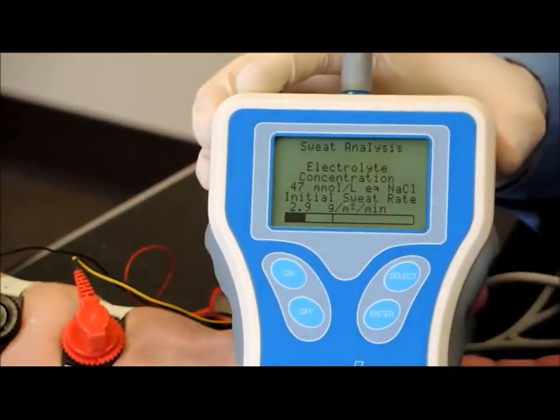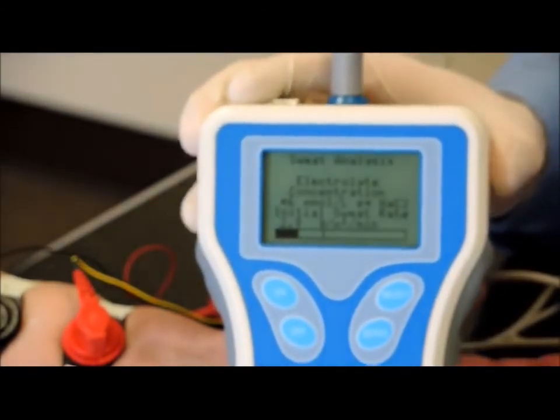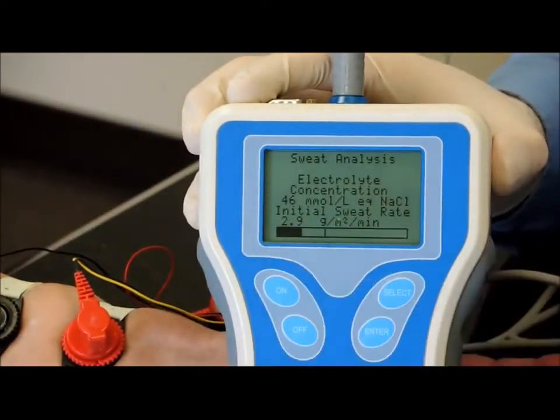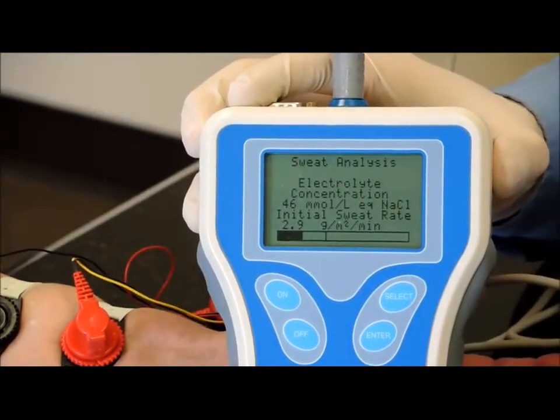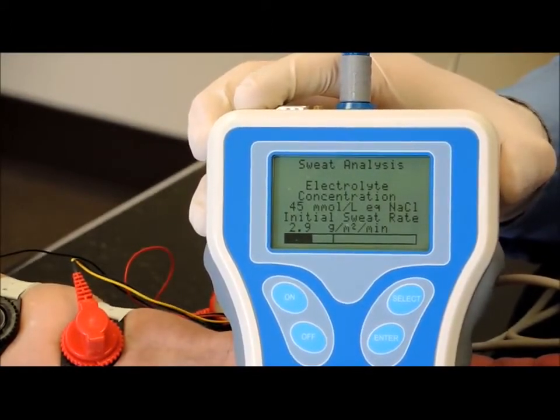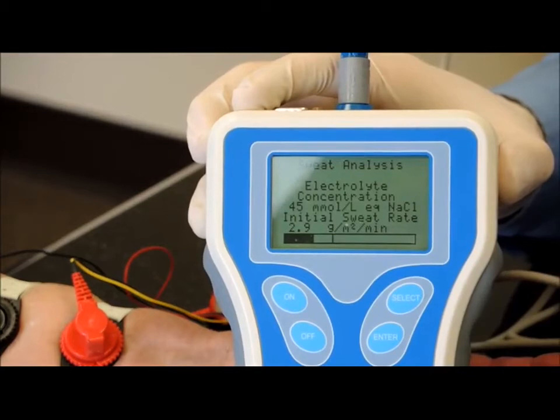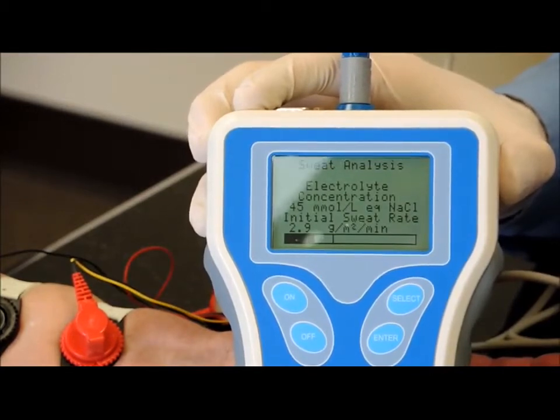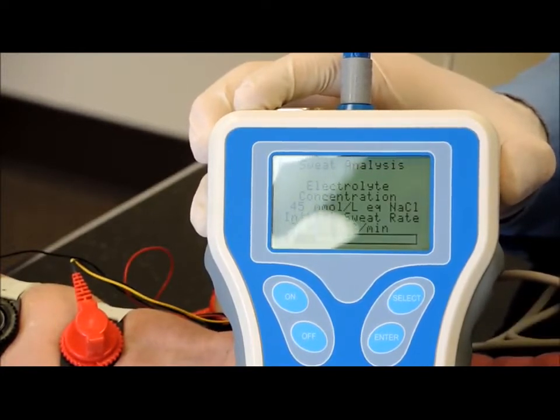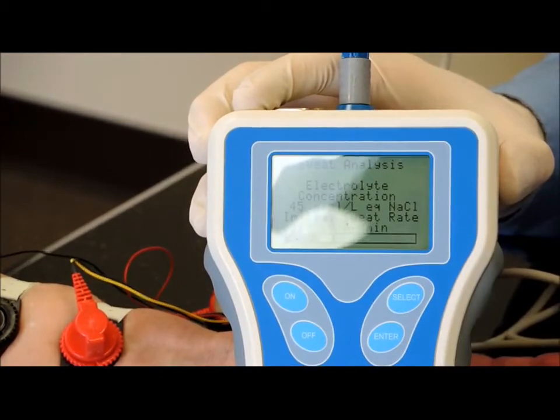You also see at the bottom of the screen a progress bar. That progress bar is set for 8 minutes. You'll also see near the first part, there's a little line. So the first 3 minutes of the progress bar is where we measure the readings, but we don't take that into account for the final reading. The final reading is based on the final 5 minutes of collection, and it's an average of those readings over the 5-minute period. So we don't average in the higher values typically seen with the first sweat that comes from the patient. We only average the values over the final 5 minutes.